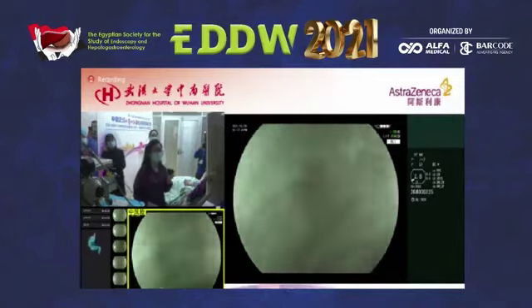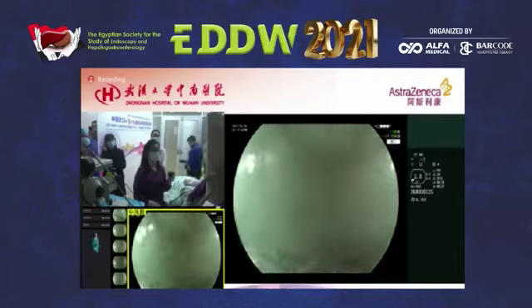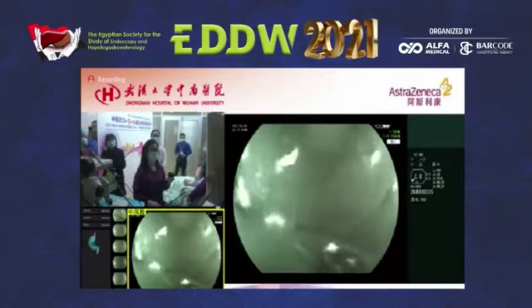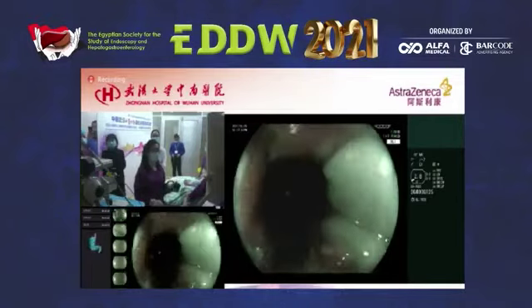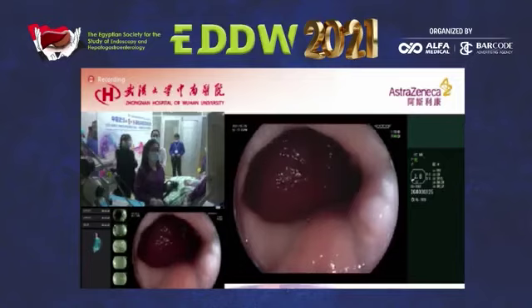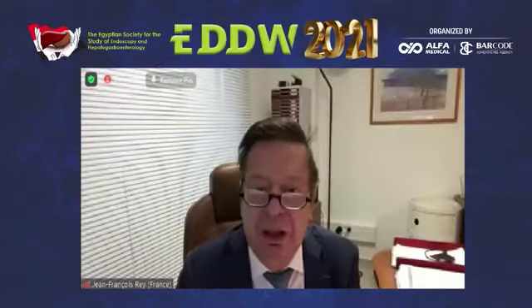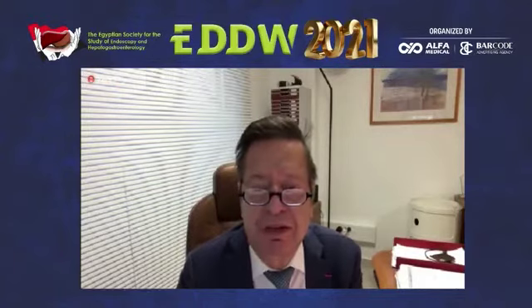Professor Ray. Good morning. Good morning, sir. Is it a sort of artificial intelligence? Because it is difficult to follow. Yes, it's the beginning of a new tool. And I think it's important now with real view.